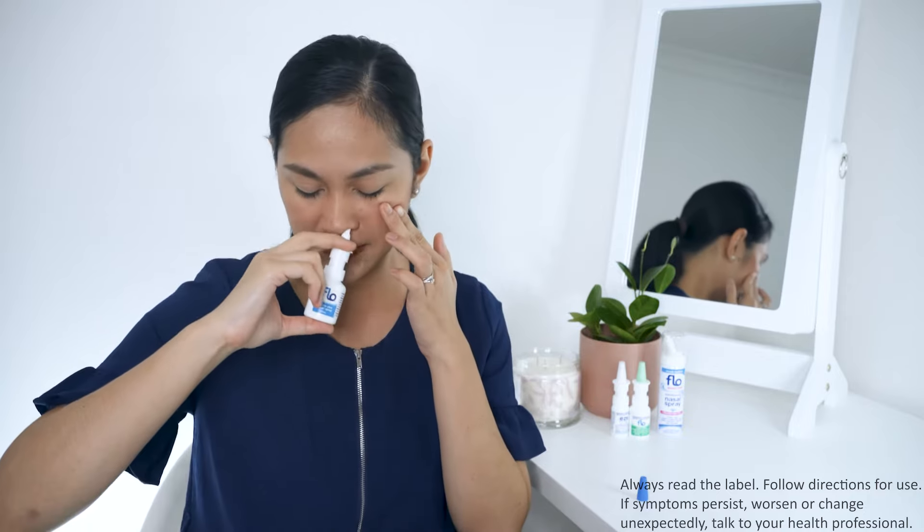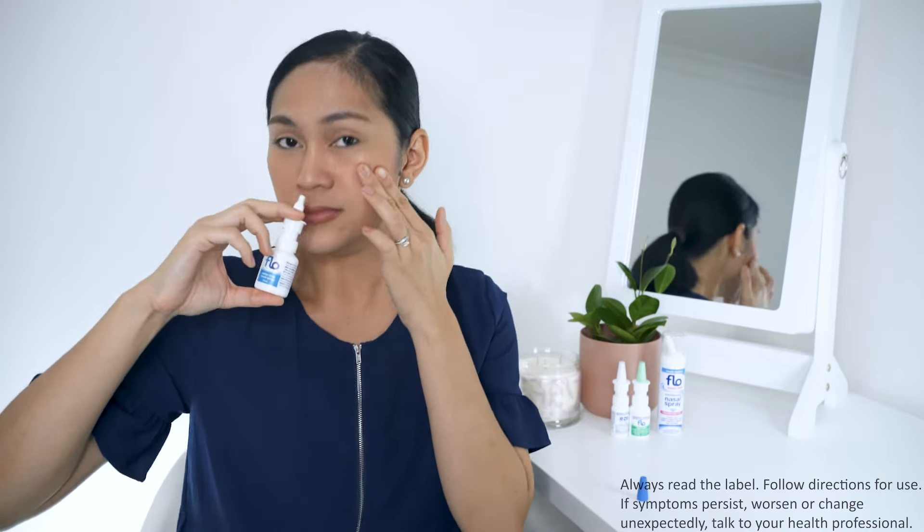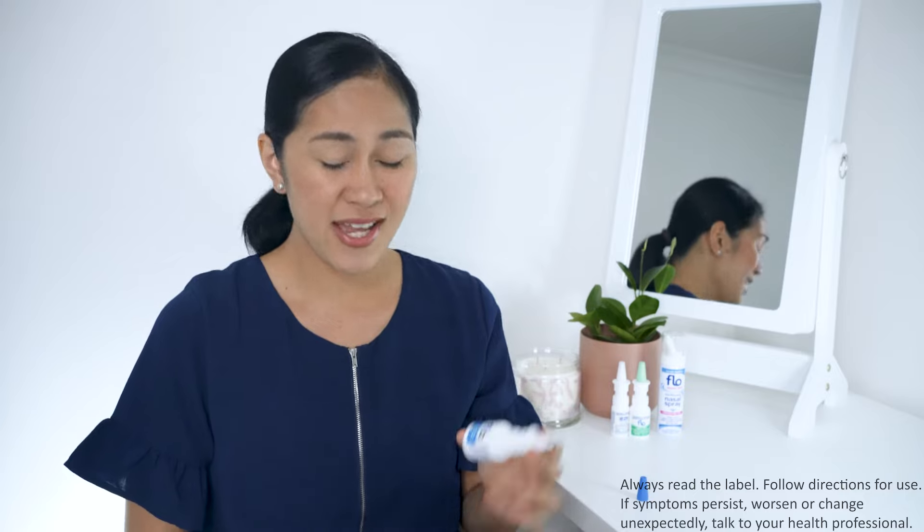Then spray. Add a dip. Choose a nasal spray that are preservative free as they tend to be gentler on your nose — just like Flo!